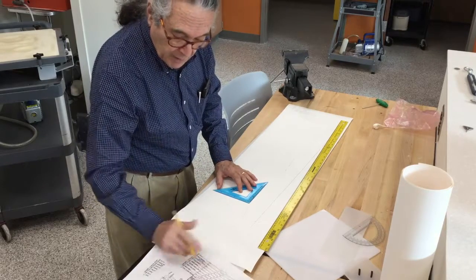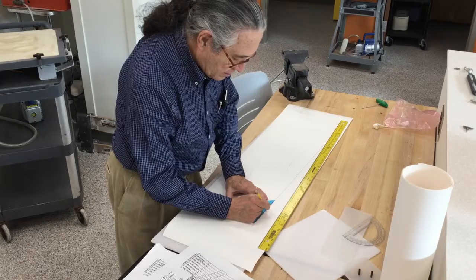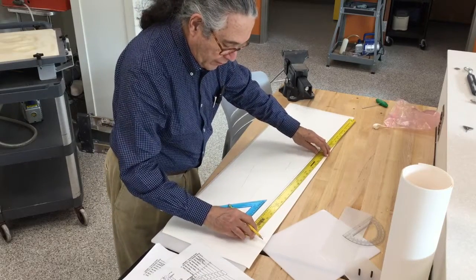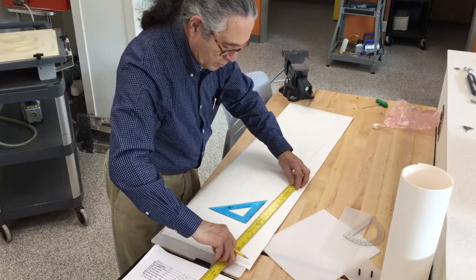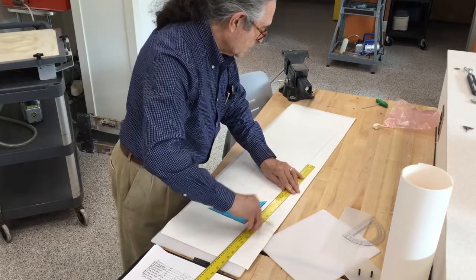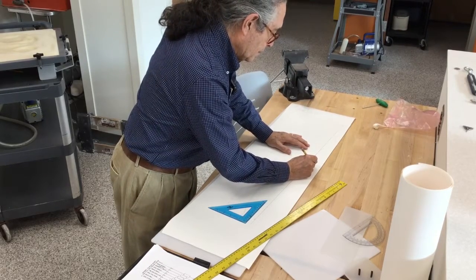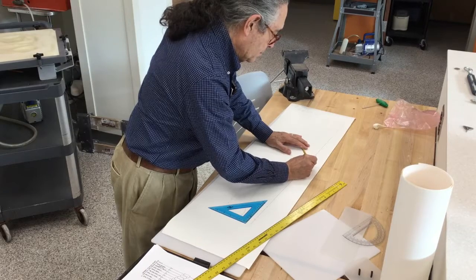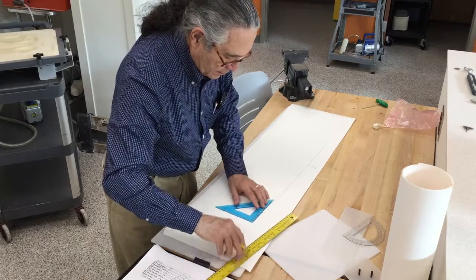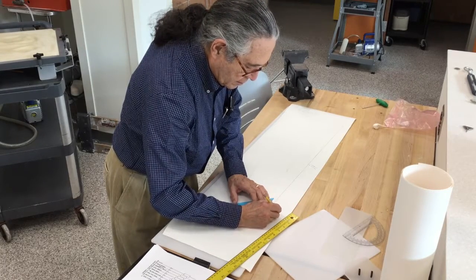The baseline to ankle height is 7.8 centimeters, so we're going to mark that. The height to the neck of the fibula is 39.5. We should label these also — the neck of the fibula and the ankle joint height.